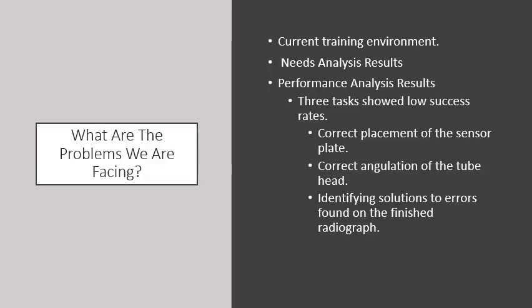3. Identifying solutions to errors found on the finished radiograph. Participants become frustrated when they must repeat X-rays. Focusing a portion of the training on identifying errors improves problem-solving skills. Correctly solving the cause of the error will diminish the need to perform repeat X-rays.